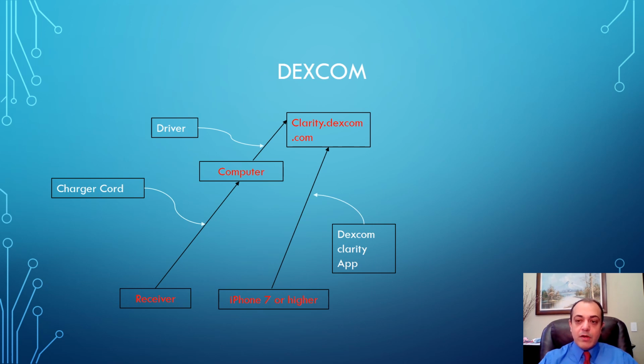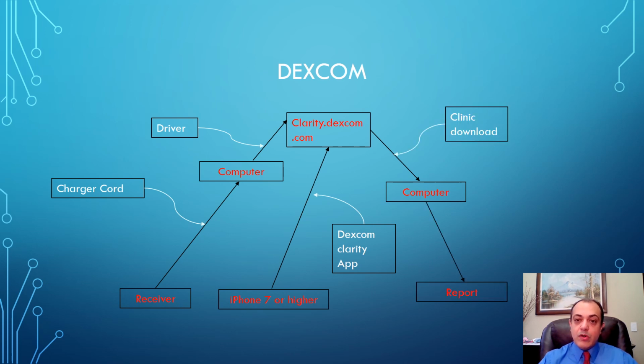In clinic, we do the reverse process, which is that we download from Clarity Dexcom to the computer and generate a report with a PDF.